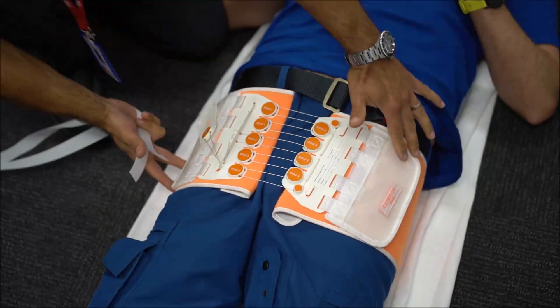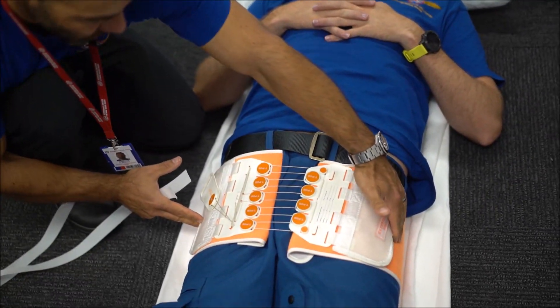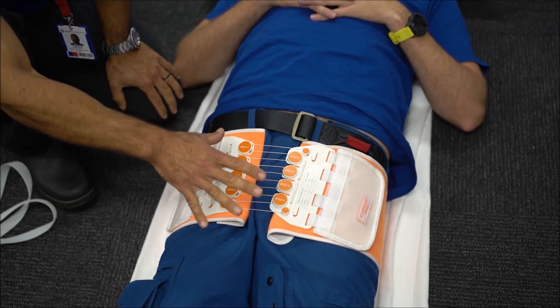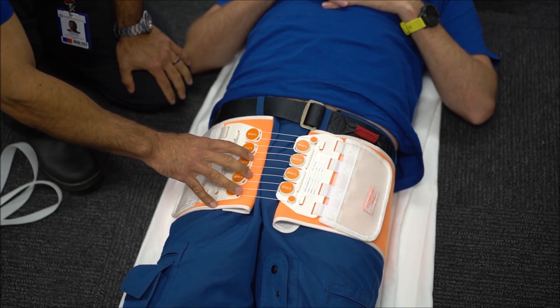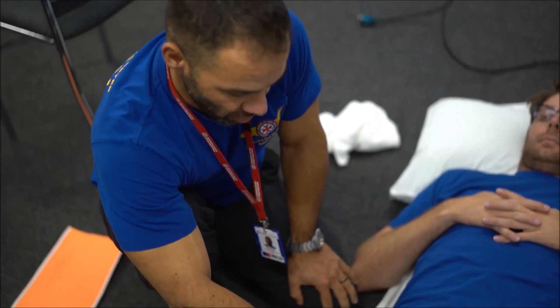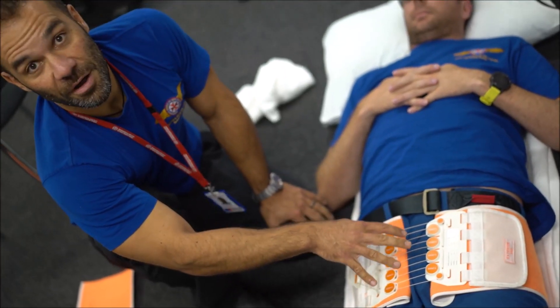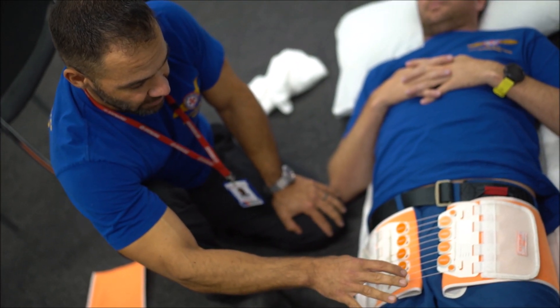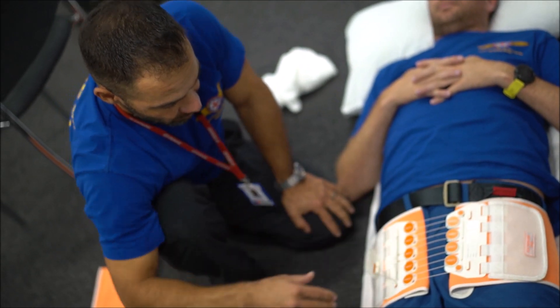This is a correctly placed pelvic binder centred over the great trochanters. The problem is with this particular design of pelvic binder: it's difficult to access the femoral vessels for procedural angio and/or central access, and it's difficult for the nursing staff to catheterise a male patient. So a lot of our patients, once they arrive in the ED with one of these on, have some issues.